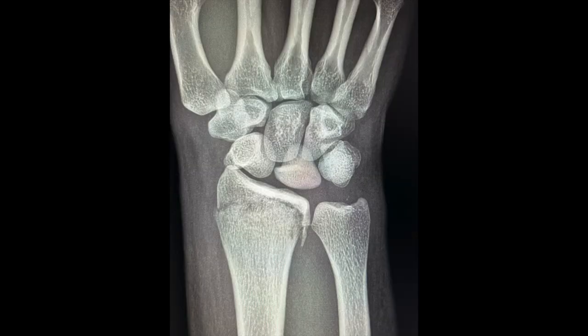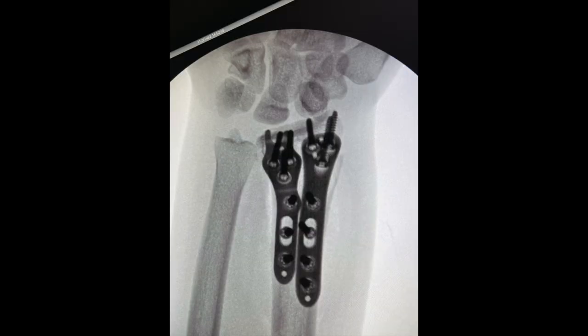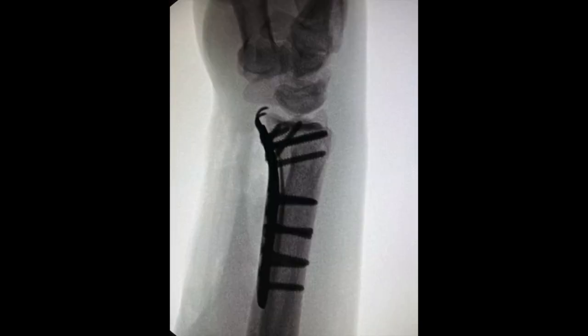Another patient presents with a very distal fracture in both AP and lateral planes. The NuClip plates are selected to secure this very distal fracture with anatomic reduction in both planes.